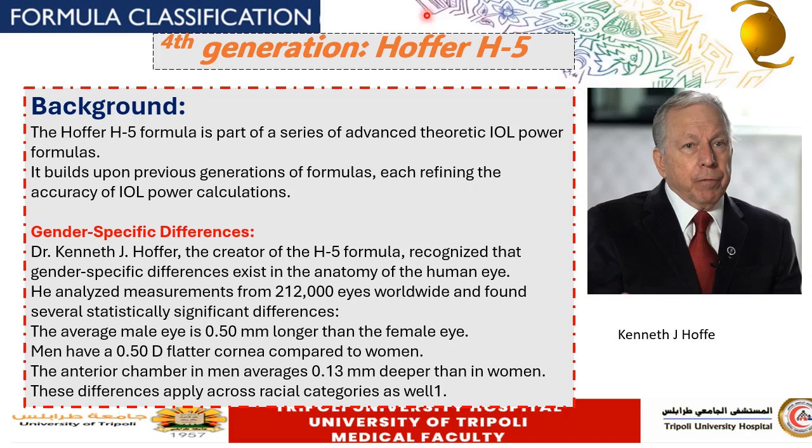The main difference between Hoffer Q in the third generation and Hoffer H5, which uses the same principle, is that he invented the principle of sex prediction and sex differences in the measurement of the anatomical structures of the eye.